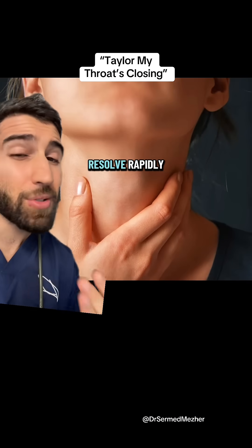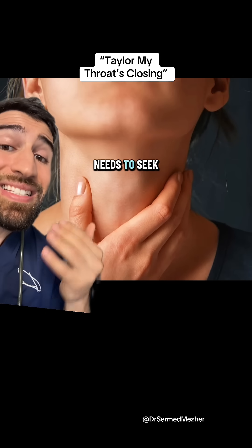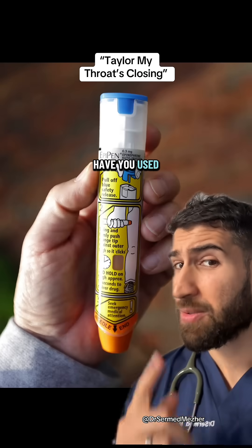The symptoms usually resolve rapidly, but the medication tends to wear off after 20 to 30 minutes, so the person needs to seek urgent medical attention afterwards in case they get worse again. Have you used one?